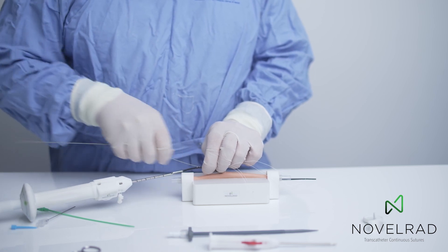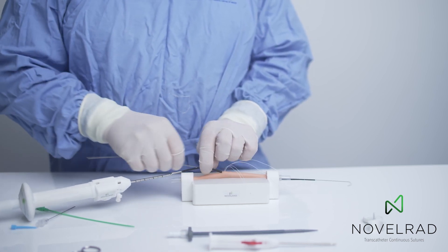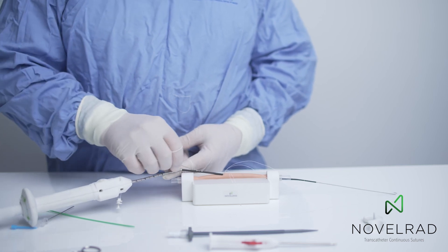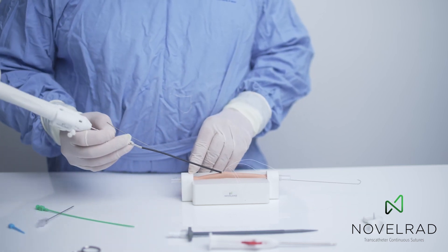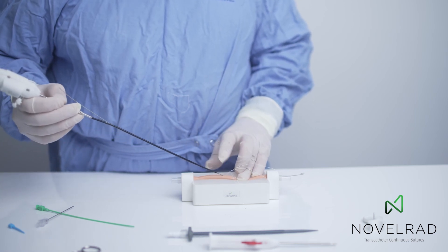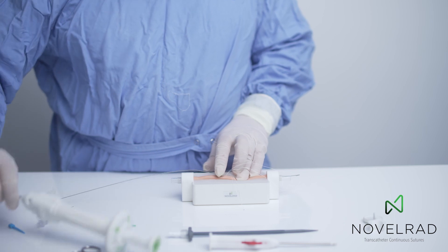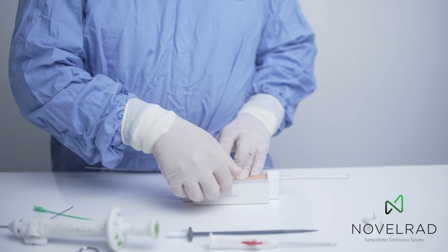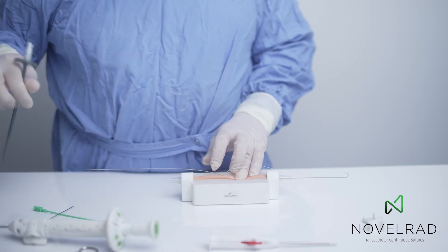So now we have a four-point purse-string suture around the arteriotomy, a guide wire in position, and we can remove the suturing system, putting a finger on the arteriotomy and holding pressure so there'll be no bleeding. If this was a true artery, we move the guide wire into position. And now we take our device.